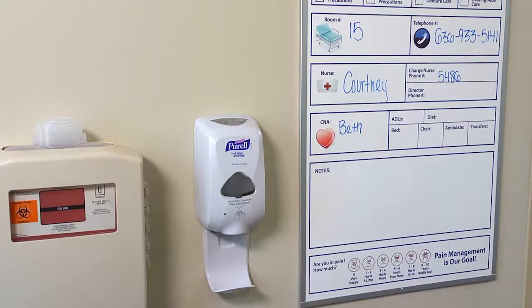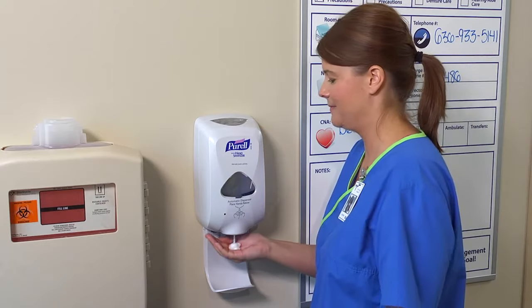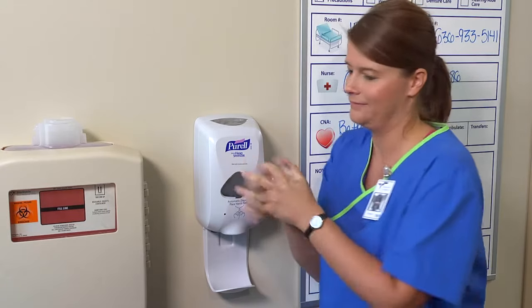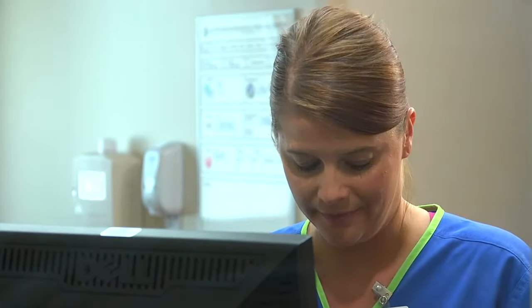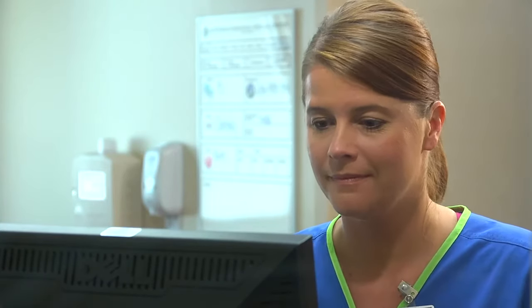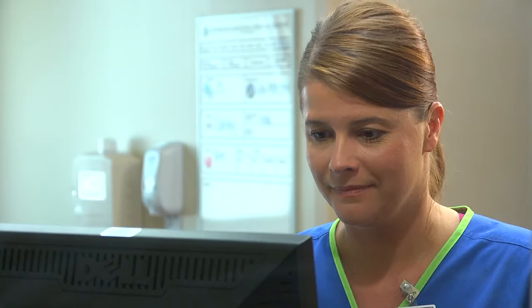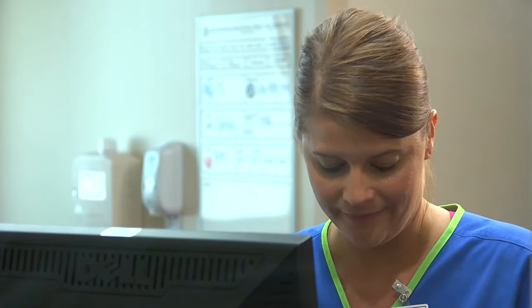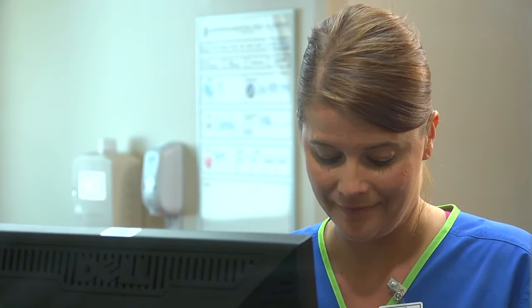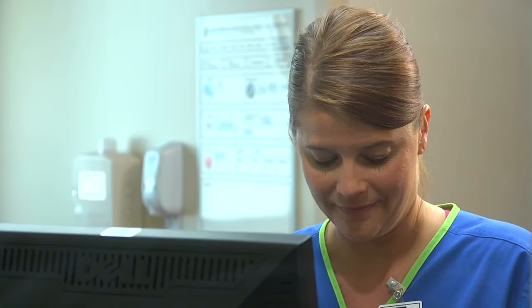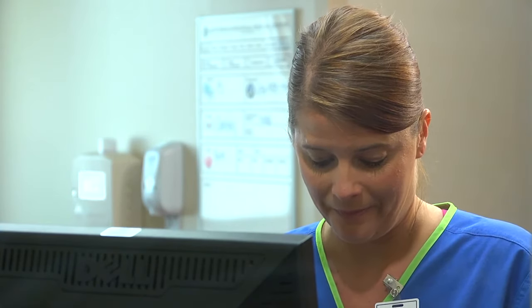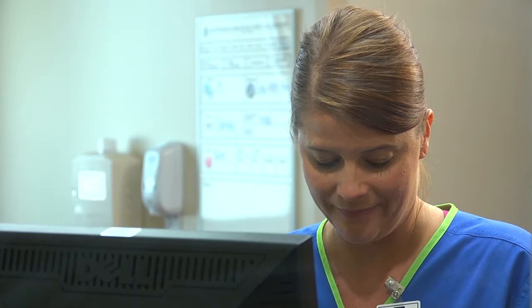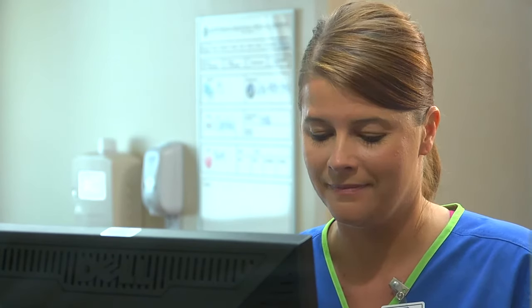Fold down the foot of the stretcher and perform hand hygiene. As part of your follow-up care, monitor the patient's vital signs, note her response to the transfer, and ask if she had any pain during the move. Record the procedure, including pertinent observations such as signs of weakness and the patient's ability to follow directions and assist. Inform the next shift or other caregivers of any assistance that might be needed.